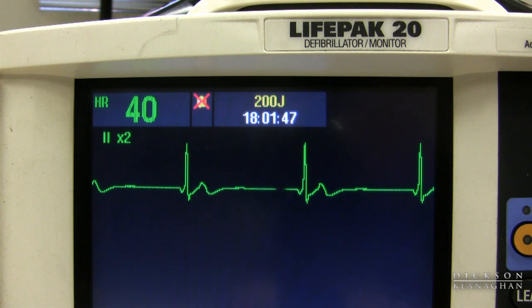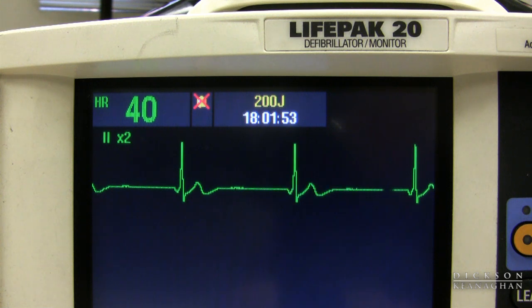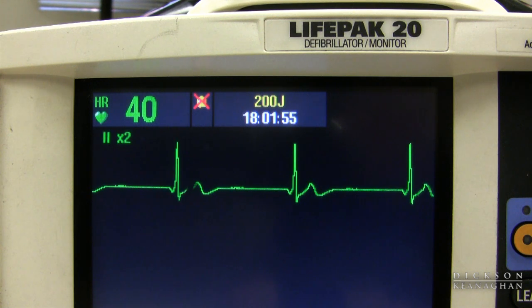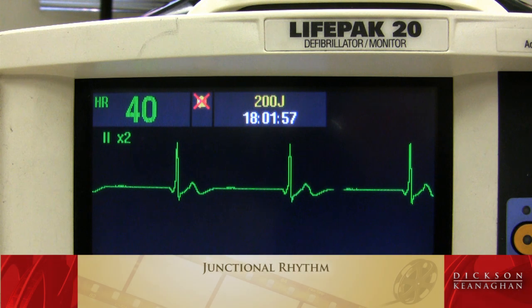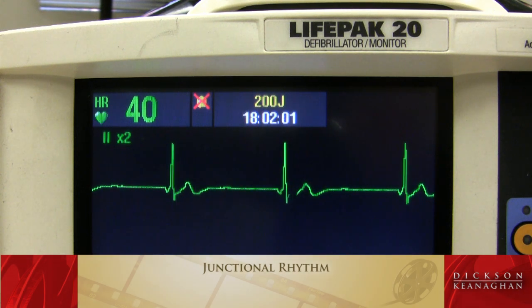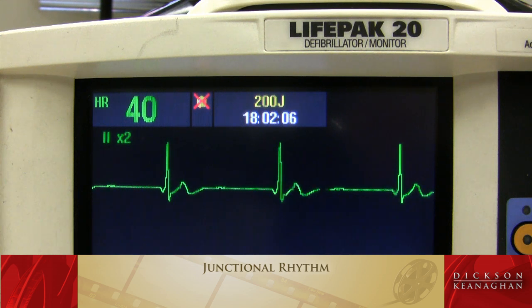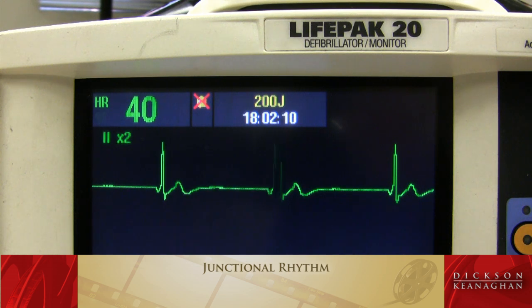Here's a slow, regular rhythm, but I notice the P waves are inverted right before the QRS — that's a junctional rhythm. Sometimes you don't see the P waves because they're hidden in the QRS, or sometimes they're after the QRS. Either way, the P waves will be upside down because of retrograde conduction. That's a junctional rhythm.